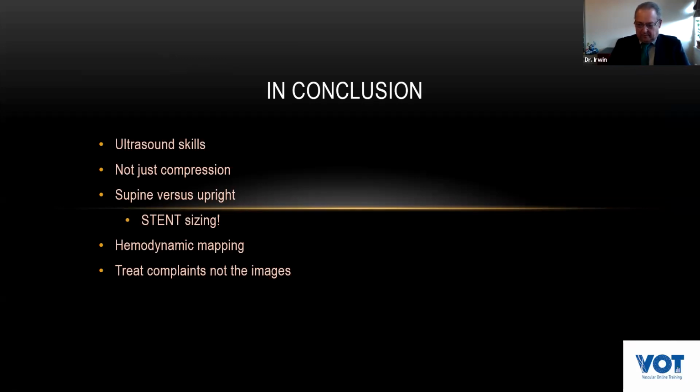So I keep warning people, use the ultrasound to help. It's not the standard, I know. I don't see very many publications telling you what kind of size stent to put in on the basis of the duplex findings, but it should be additional, complementary to all the other modalities being used.